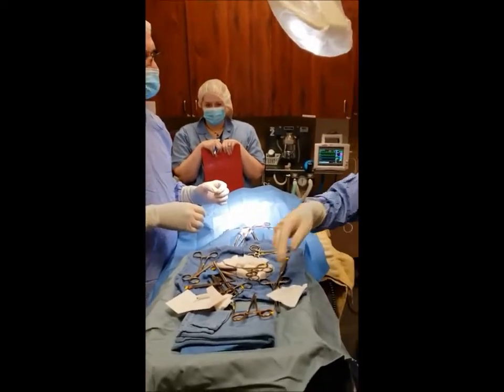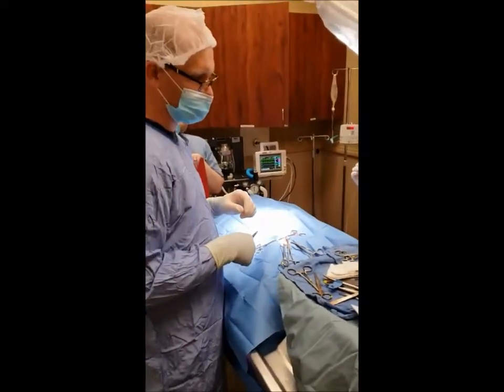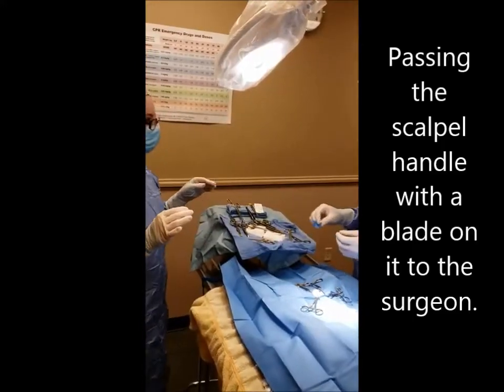Okay, Kenzie, can you hand me the needle drivers, please? Yes, sir. And the brown Addison forceps. Excellent, thank you. You're welcome. Okay, you can hand me the blade now.